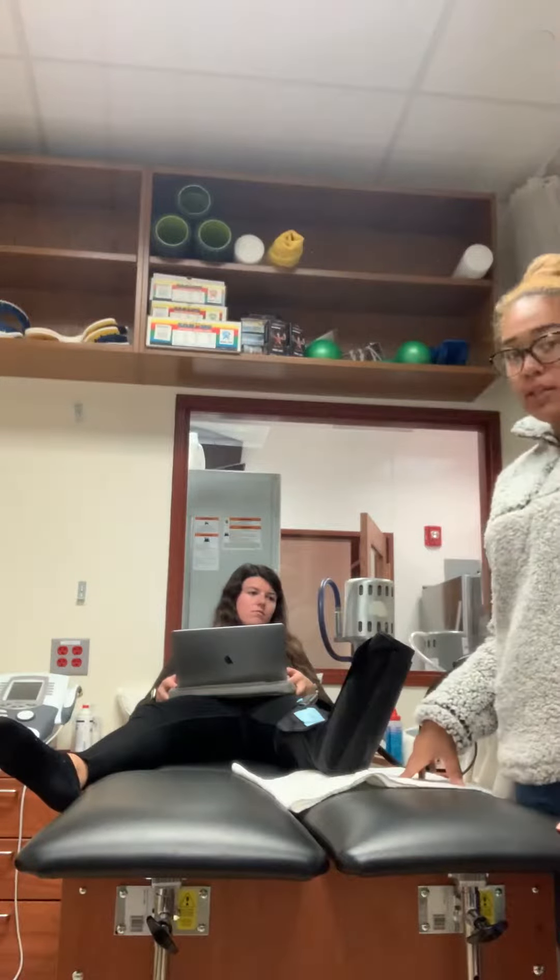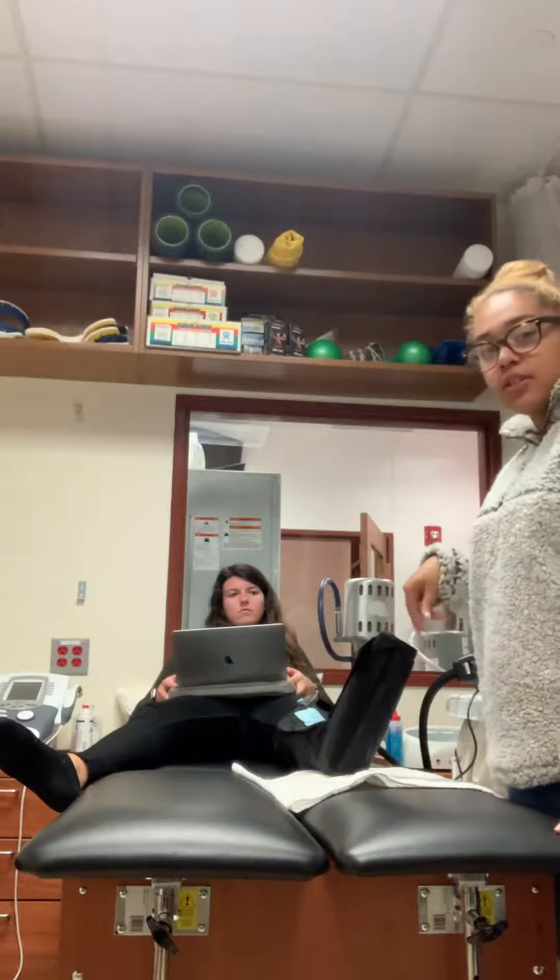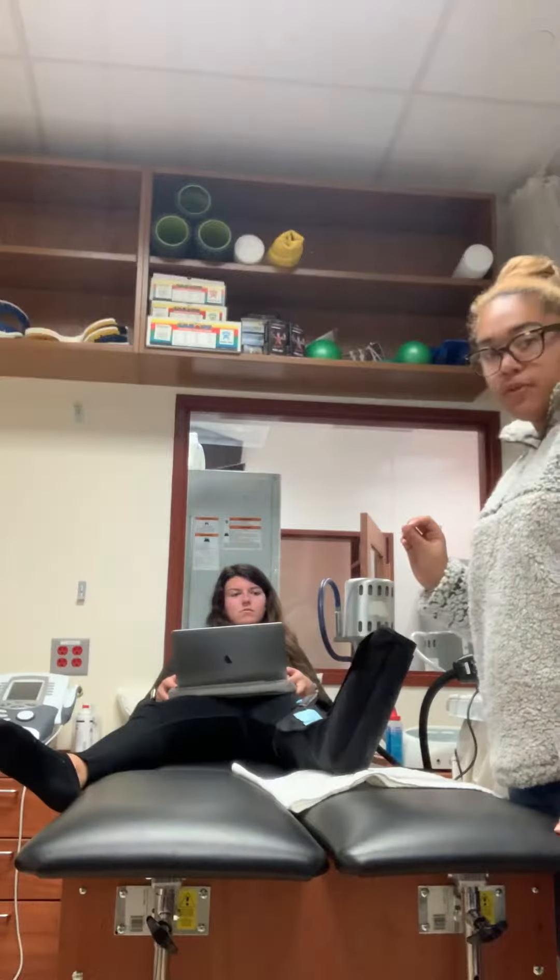We're going to set her up for 15 minutes. She has her sock off so we're able to see the toe and make sure that she's still getting all the blood flow during this.